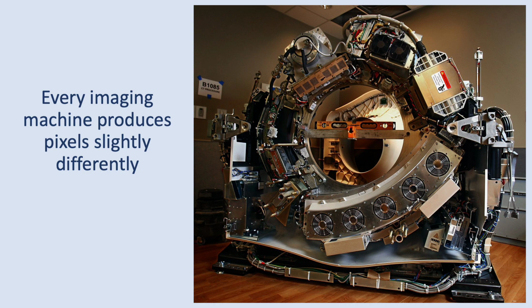Here's a CT machine with cover off. It's a hugely complex machine. So what's happening is the thin X-ray beams get generated on one side and they shoot through the patient and get detected on the other side. And the machine rotates very quickly so that you've got these beams of radiation shifting through the patient as the patient goes through the scanner.